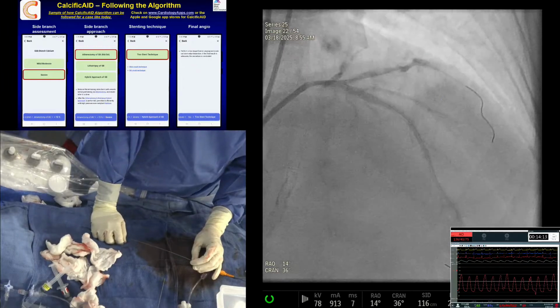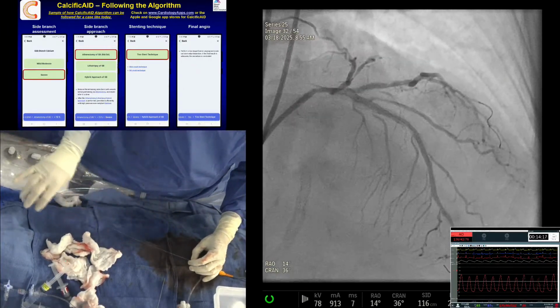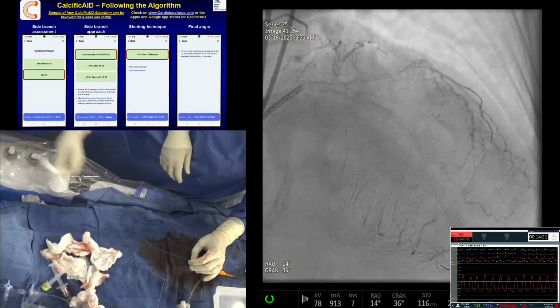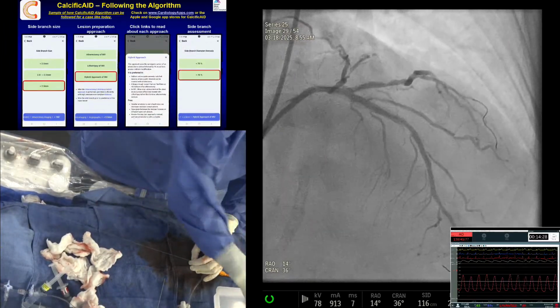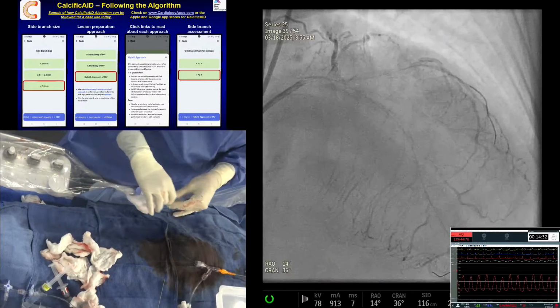Although it looks okay at the ostium, I think we come up to the ostium. We are ready with the two stents. Actually, first put one stent anyway, 3.0 by 33 in the main LAD. Go. Yeah. Gloves. Get the IVUS for the diag.